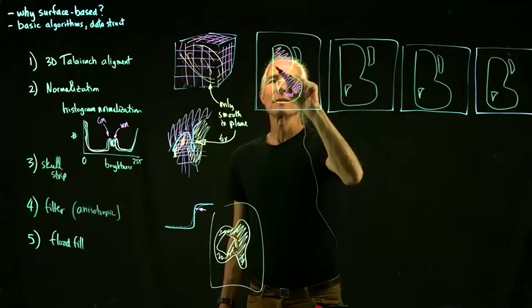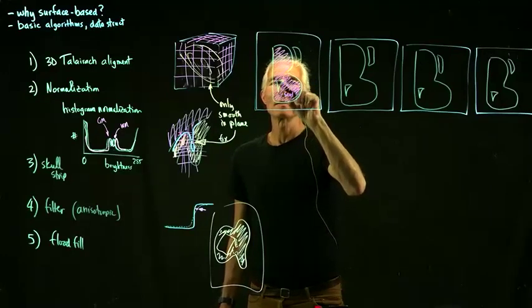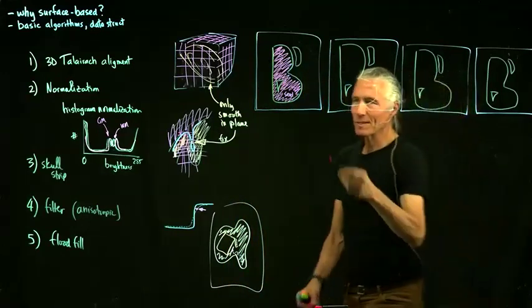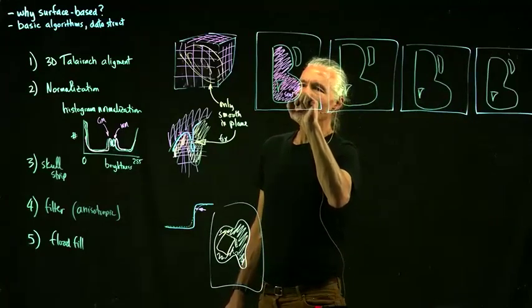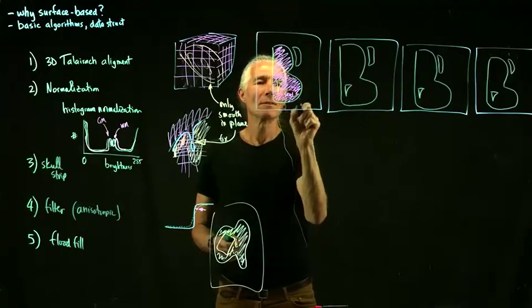So you'll basically fill up a block of mostly white matter, but you're going to have a ventricle in there. And if you're saying that I'm going to define the surface as the boundary between filled and not filled, well, then there's a piece of the surface in here too that we don't want. So that was our first seed.